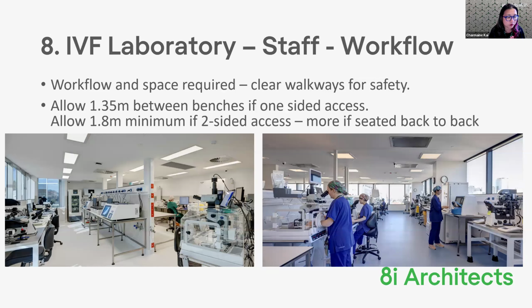So 2 labs. The one on the left is a baby lab, 60 square meters. It has about 1.3 meters between the benches. So between the ICSI rigs and the bench that has the time-lapse incubators, there's about 1.3, 1.4 meters. It allows for people to work at the benches and people to still stand and observe what they need to do in terms of the incubators, without any collisions. But it is tight enough so that we're not having a lot of space.